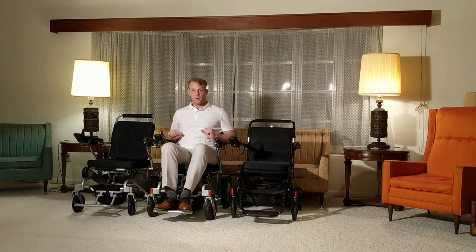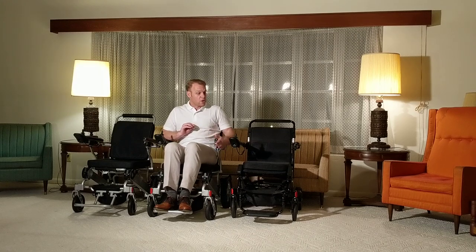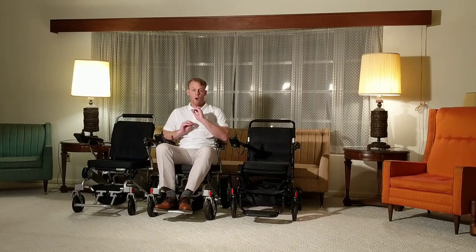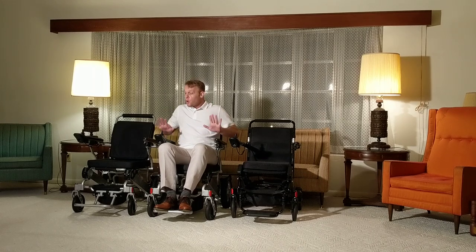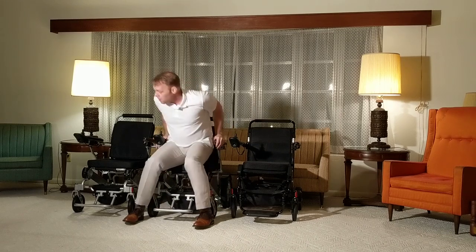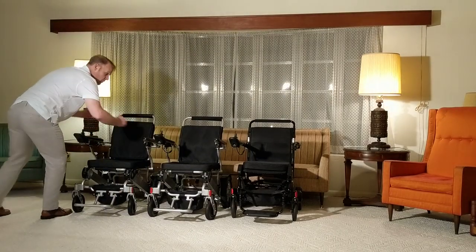So for just a slight increase in price, you get a whole lot more chair. However, this chair without the batteries weighs 50 pounds, where the Airhawk without batteries weighs 41 pounds. Each Airhawk battery weighs 5 pounds, making the total weight of the Airhawk 51 pounds. Total weight of the AHXLS refurbished unit is 58 pounds.